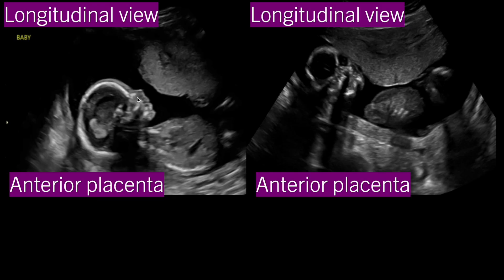Here in this image, this is the intrauterine fetus, this is the fetal head, and this is the fetal body. In front of this fetus, there is a hyperechoic structure. Similarly, in this image, these are the fetal parts and in front of this fetus there is a hyperechoic structure. The placenta is normally hyperechoic. If we see a hyperechoic homogenous structure in front of the fetal parts — in the upper part of the screen — then this is the anterior placenta.